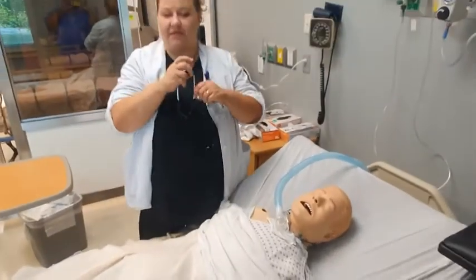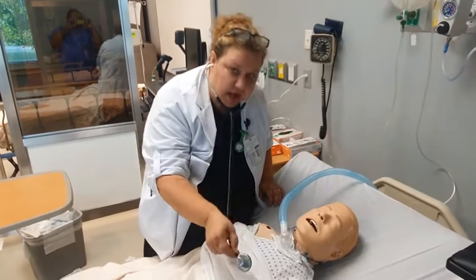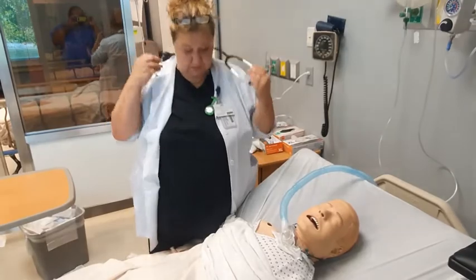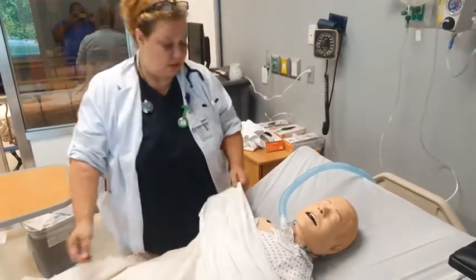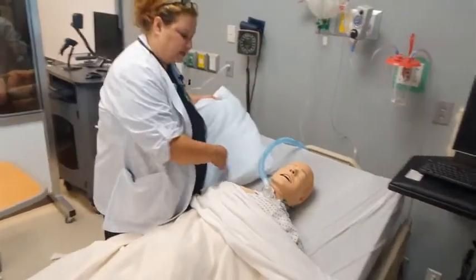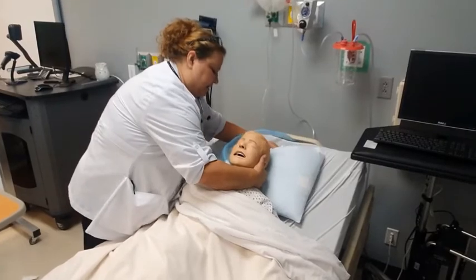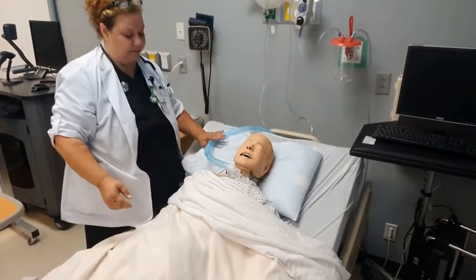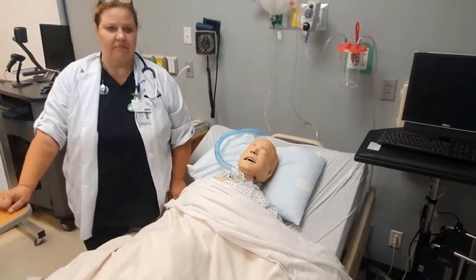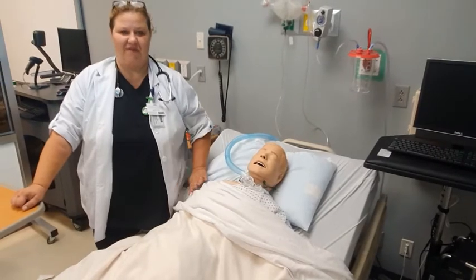And of course, you would reassess the respiratory status by listening to their lungs at all the points that you've been taught. Make sure they are comfortable, the client. And then you would take your pillow for Mr. Smith, making sure that he's comfortable again. Mr. Smith, I'm going to raise your head up and put your pillow back. Now you will document time of procedure, condition of skin around stoma, amount and color of drainage, respiratory status, and their tolerance. Okay, then you have completed your trach care.